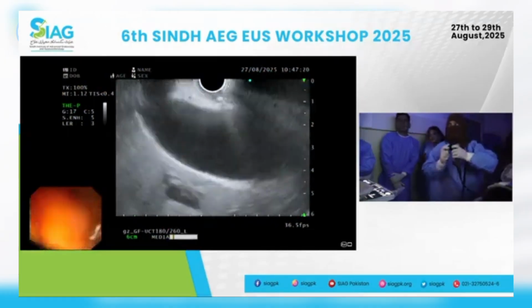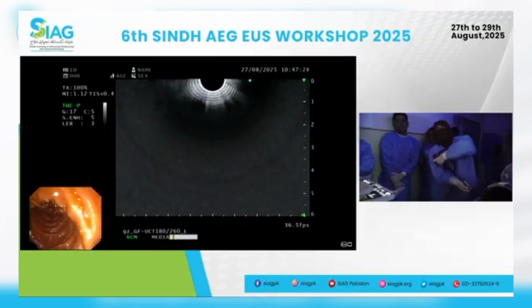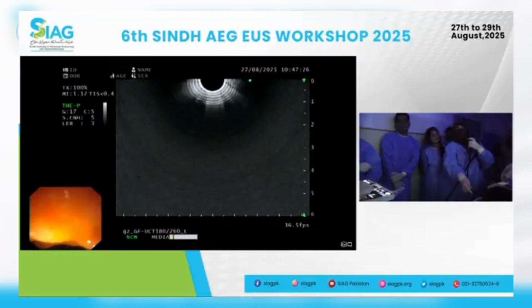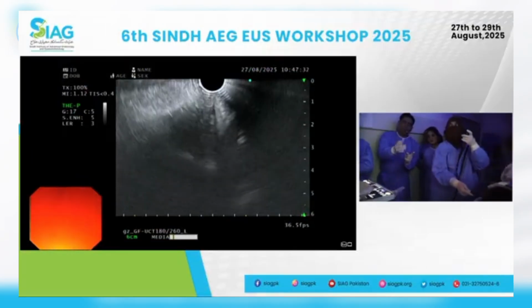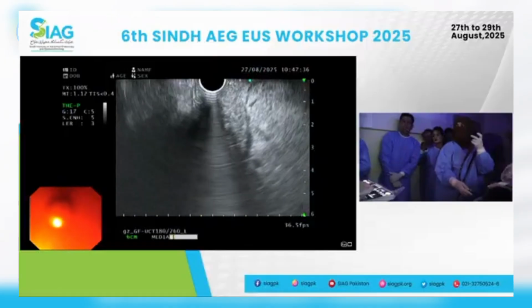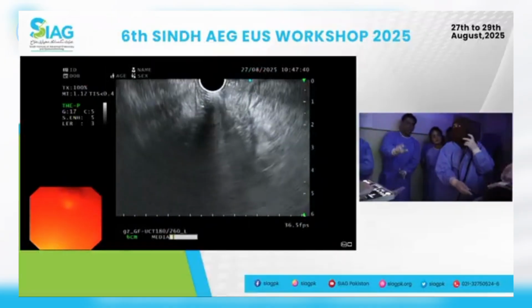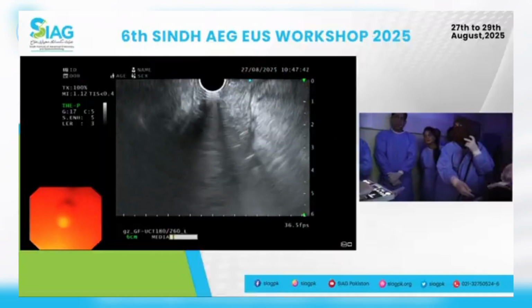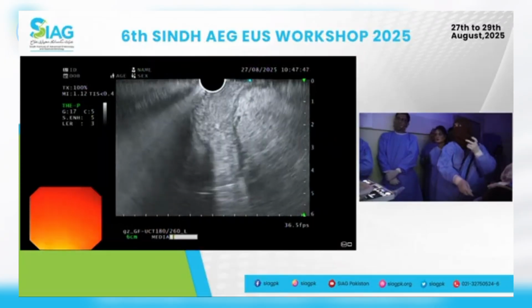Big wheel towards you. Yeah, good. Advance the scope and slowly shorten, slowly. Good. That's it. So in the previous occasion, because you fell back, I wouldn't take it all the way out. I'll just suction it and then slowly start to withdraw under the echo-endoscopic view, rather than endoscopic view alone. And remember that our target is to identify the aorta.